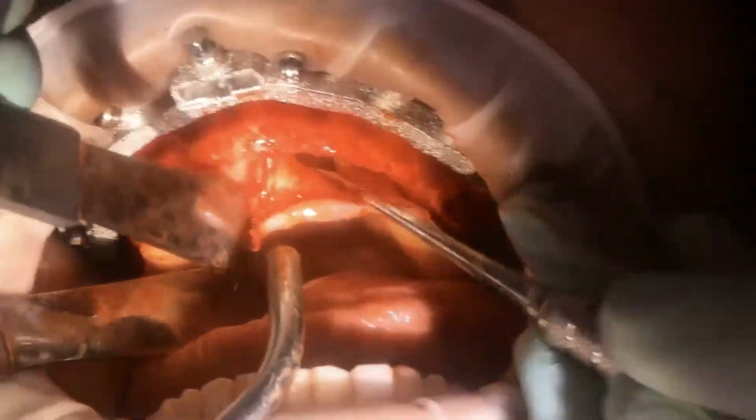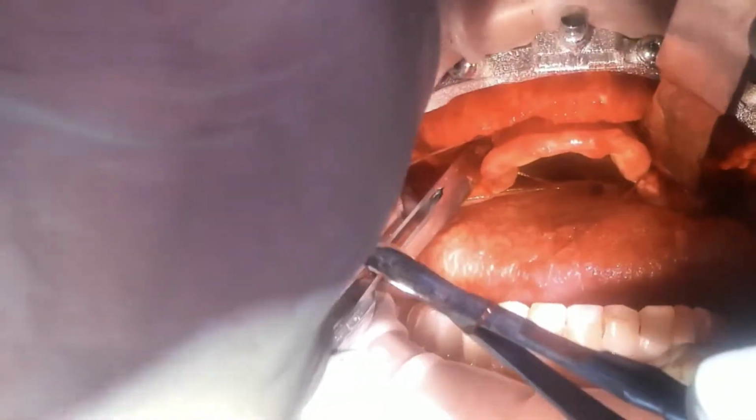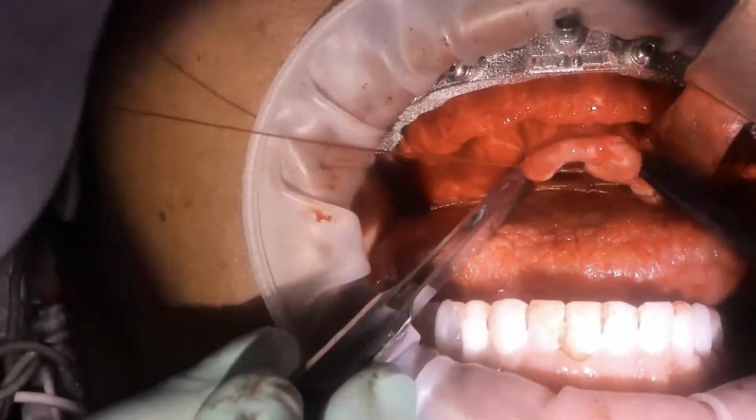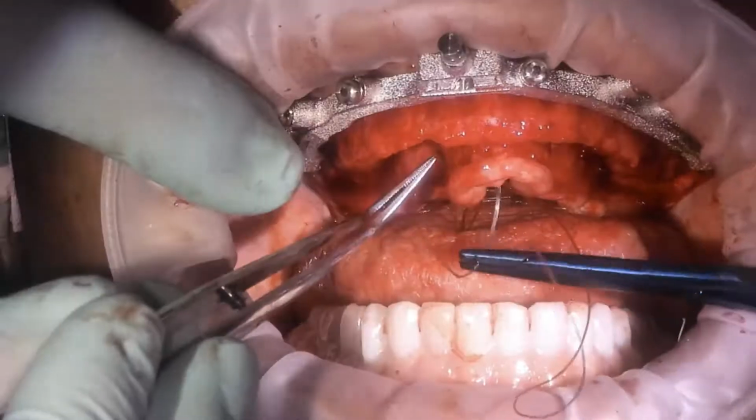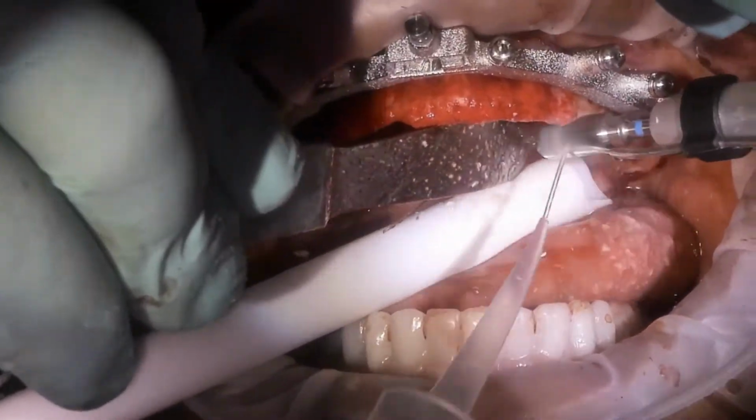Once the fixation base is seated, the rest of the Chrome surgery follows all other Chrome surgical protocols, which is to reduce the bone to the level of the fixation base. I know a lot of doctors tie off the lingual tissue with a suture, and then of course perform all the bone reduction.